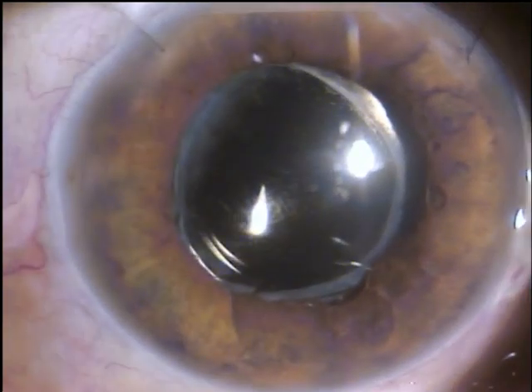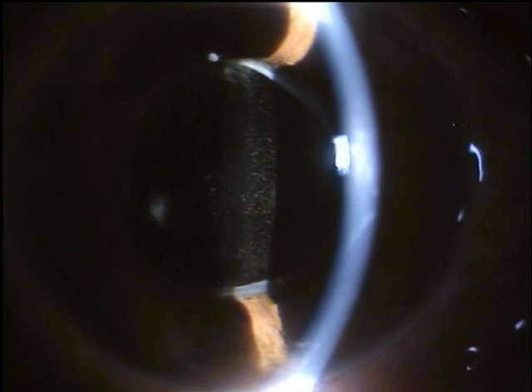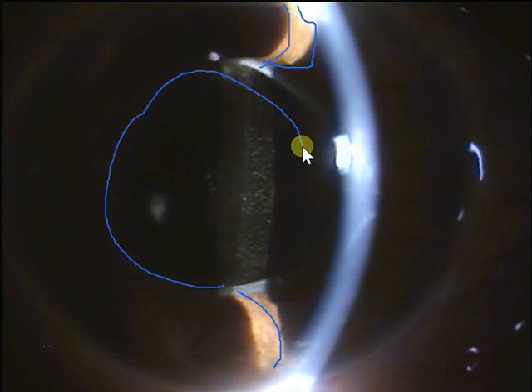And now I'm going to show you the iris bombé. When you make that slit, you can see there's 360 synechiae formation, and there's formation of that iris bombé. If you look over here, the iris is bowing forward like this, and similarly it's much easier to see over here. So this is bowing forward, and he's got a posterior synechiae all the way up. So you need to do a YAG iridotomy anywhere supranasal, supratemporally, and that is going to flatten the iris.